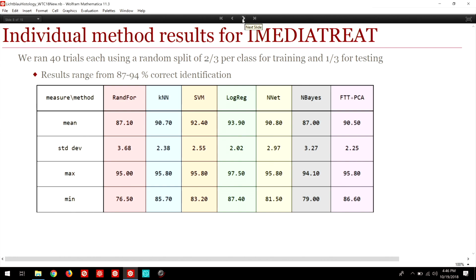Okay, so to save a bit of time, we've cut a little bit of information about the details of this FFT plus PCA. I'll just say in brief, it's two steps of dimension reduction. We use some kind of Fourier transform and take the low frequency components. That's step one. And then we flatten these smaller dimensional matrices into vectors, so each image now becomes a vector.